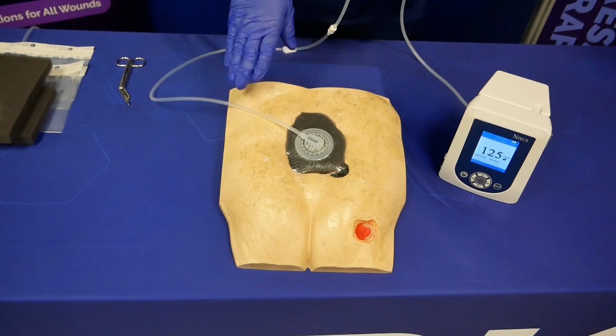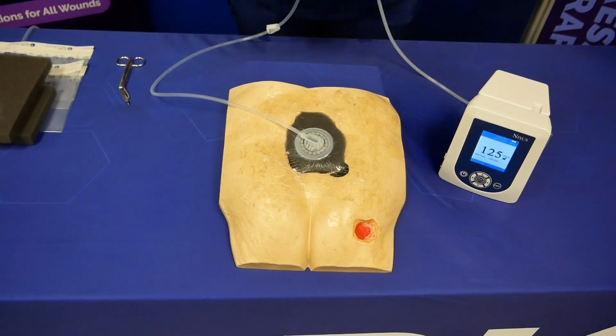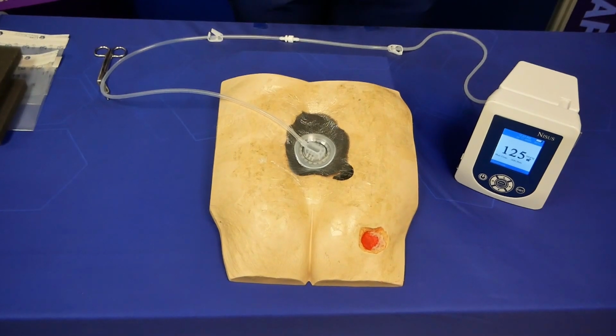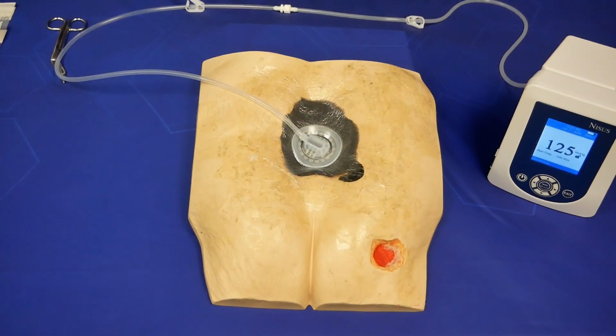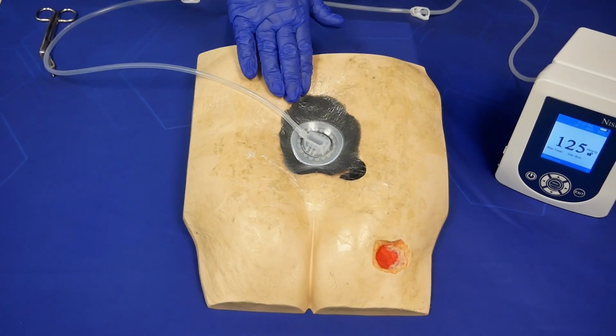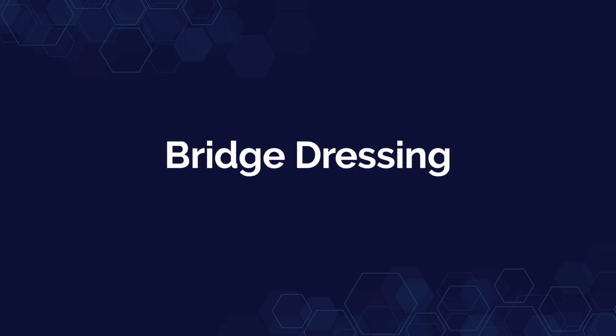And so now we're ready to engage the dressing and the pump. And so we've got this nice draw down, and your pump is nice and quiet.